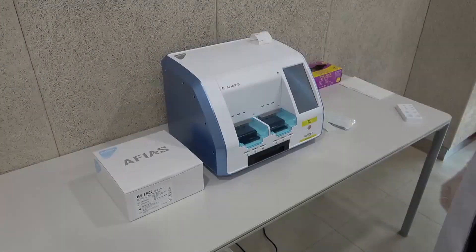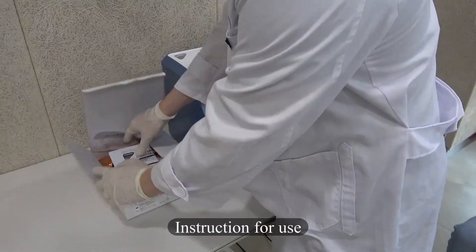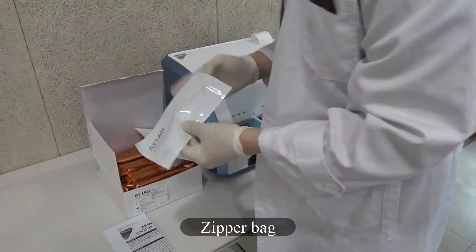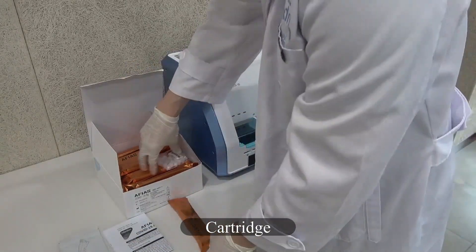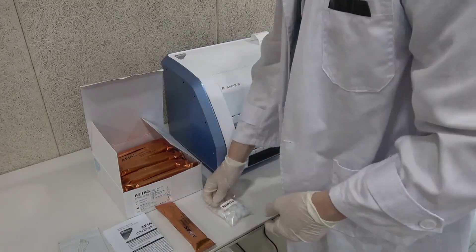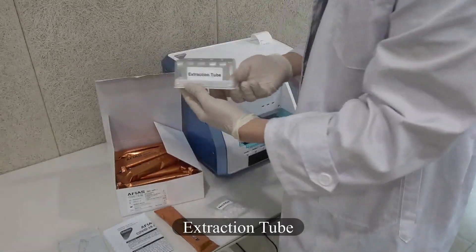AFIAS-6 COVID-19 Antigen Test Procedure. Instruction for use. The kit includes: a zipper bag, a cartridge, a nozzle, and an extraction tube.